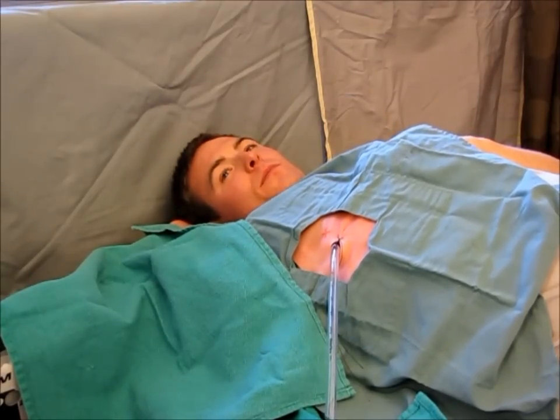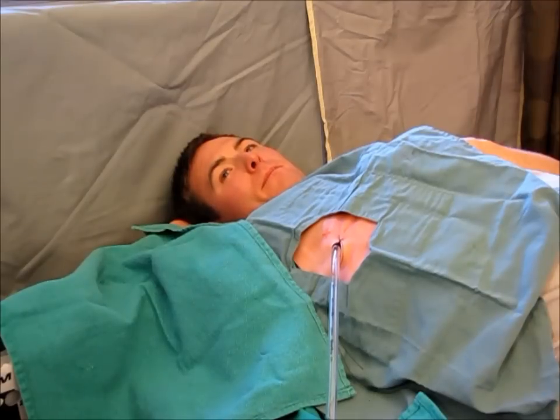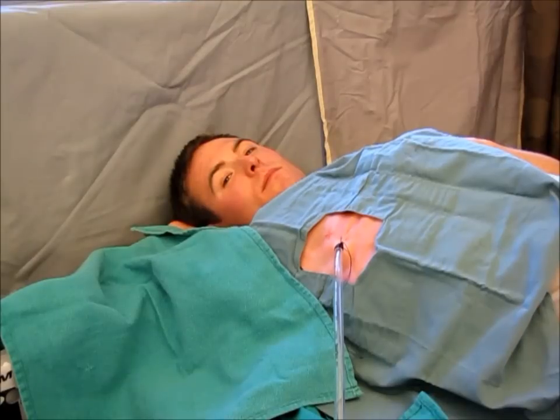It is important to have the patient blow out through pursed lips as it increases the thoracic pressure and you can hear that the patient is in fact performing the maneuver. When pulling the tube out, it is again important to warn the patient that it may feel uncomfortable or even painful, and warn the patient that this time you will be taking the chest tube out.